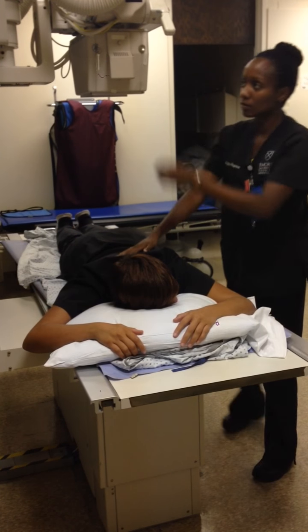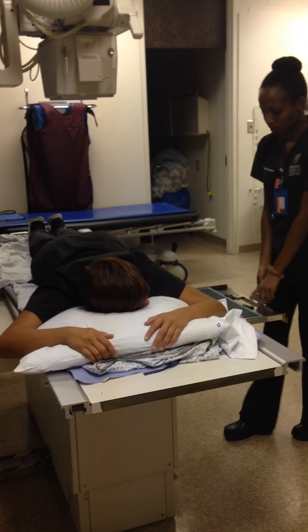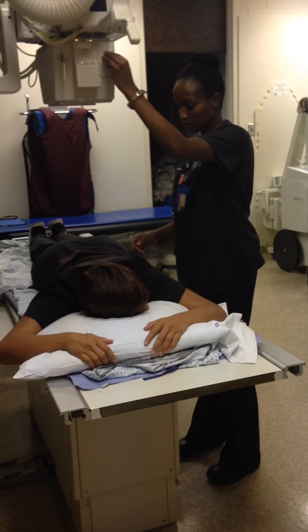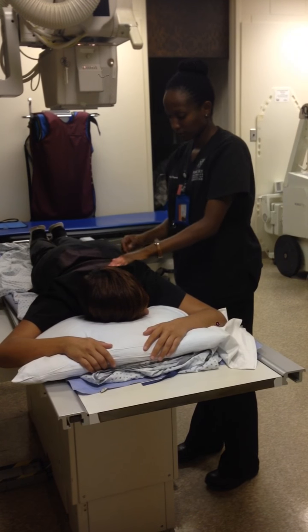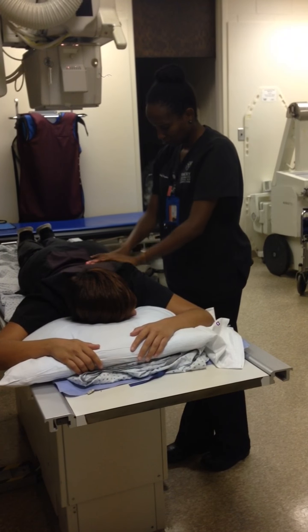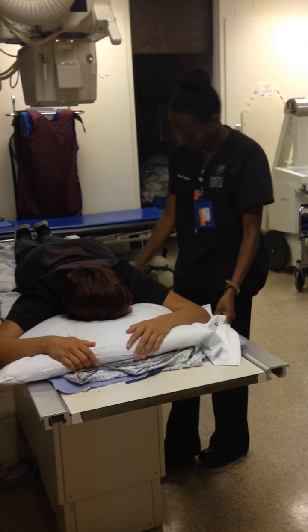The cassette is still 14 by 17 lengthwise, but the field will be collimated to 11 by 17. The central ray is perpendicular to the image receptor at the level of L1 and L2. Centering left to right is halfway between MSP and the lateral border of the abdomen on the patient's left side.